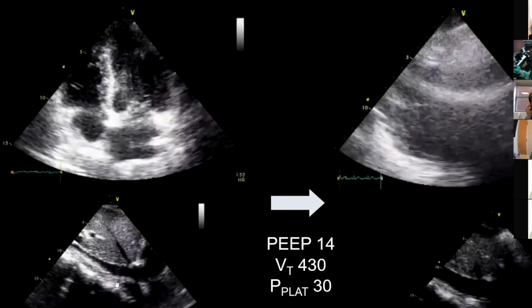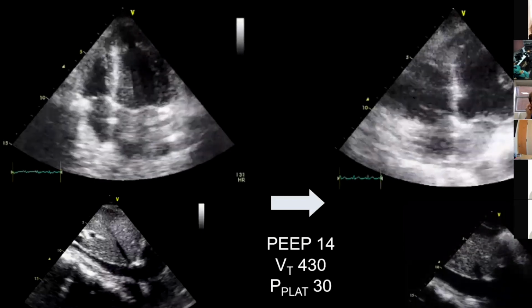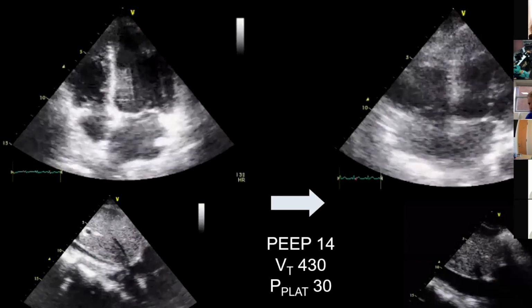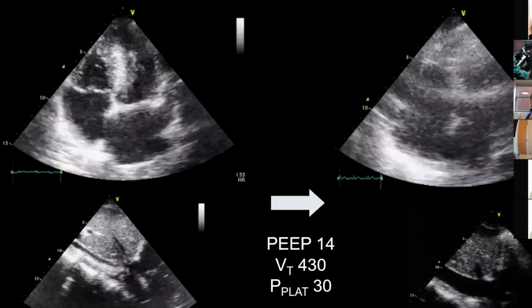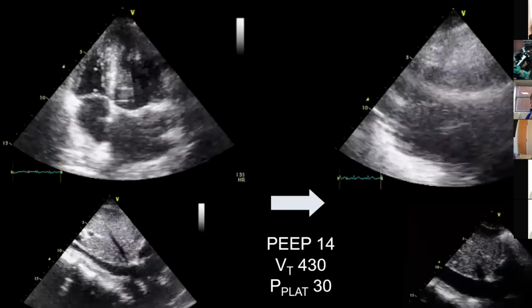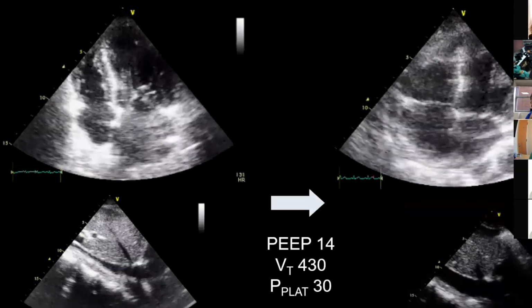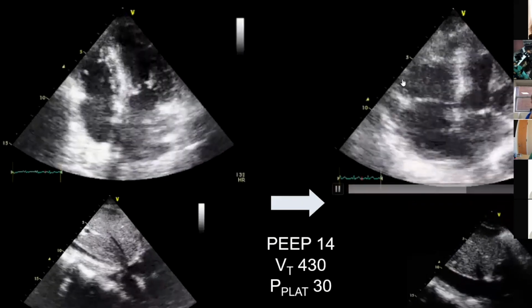And just to make this even clearer, I'm going to show you a picture. This is a patient who started off septic, on a vent, and someone increased the PEEP. I think this was a ROSE patient where we were trying to get them on board with the high PEEP protocol. Previously, Utah wasn't really doing it. We said we did high PEEP, and when we looked at the numbers, we weren't actually doing that. But when we actually increased the PEEP, you can see the RV just balloons way up.